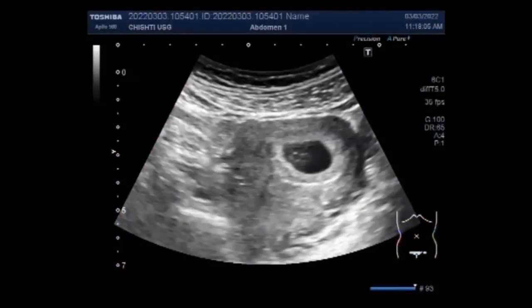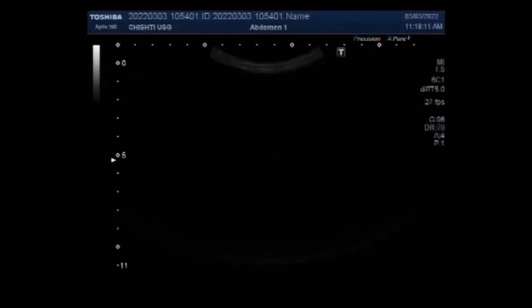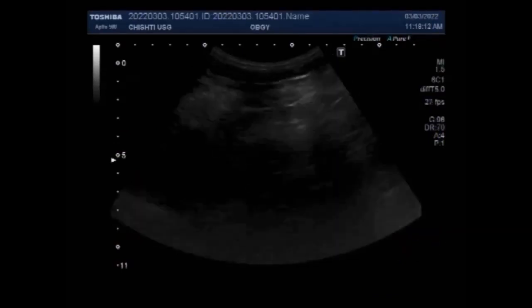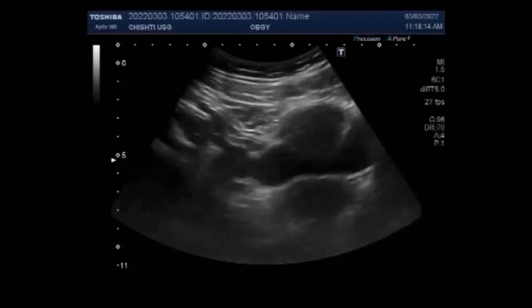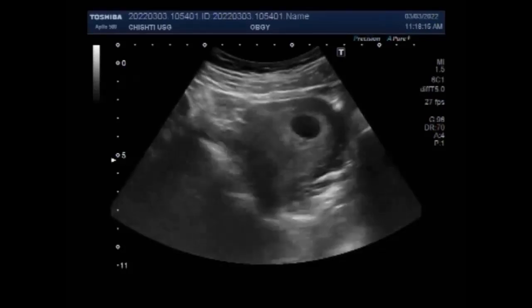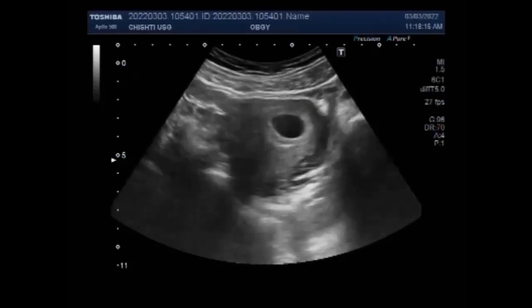Dear viewers, I hope you are all fine. This ultrasound video shows a case of early pregnancy of about 6 weeks with an ovarian cyst.